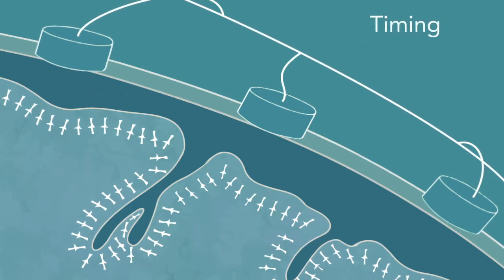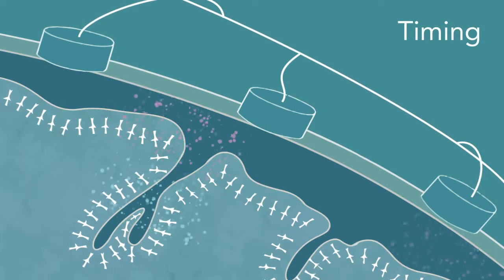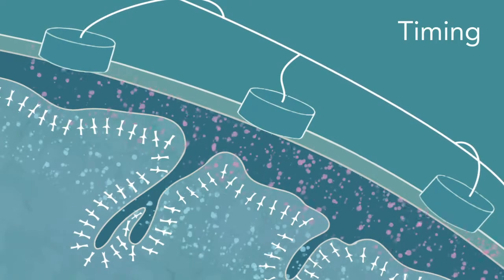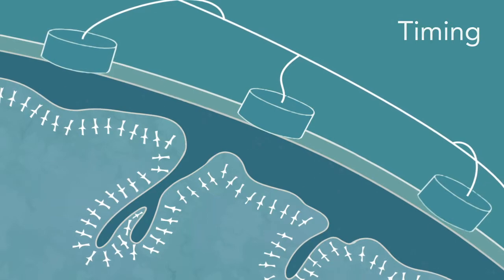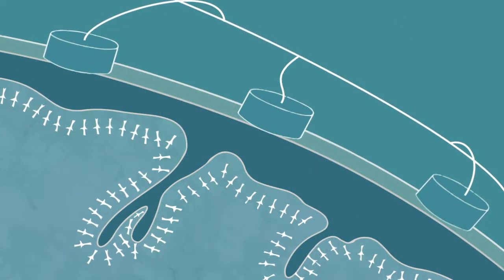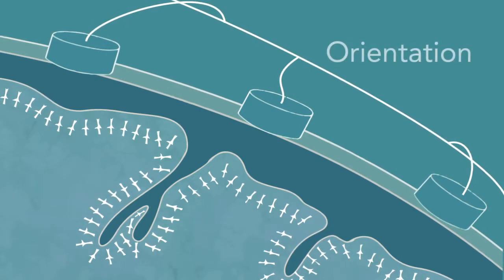When neurons fire at different times, the dipoles do not sum together as easily and the overall signal is weak. But look what happens when they fire at the same time. One can think of synchronous dipoles as a choir, harmonizing together to form a stronger EEG signal. However, neurons firing at the same time is not the only factor that affects the EEG signal.